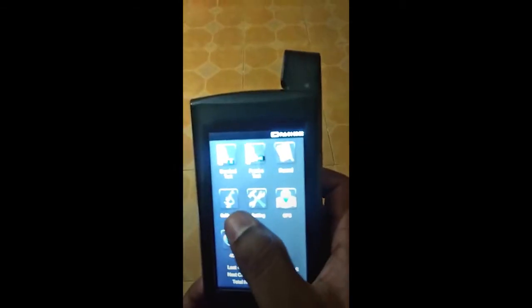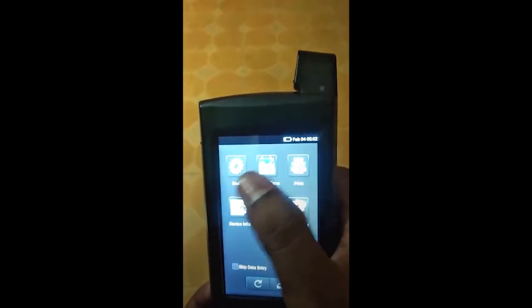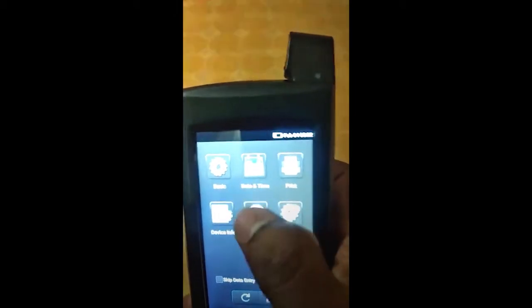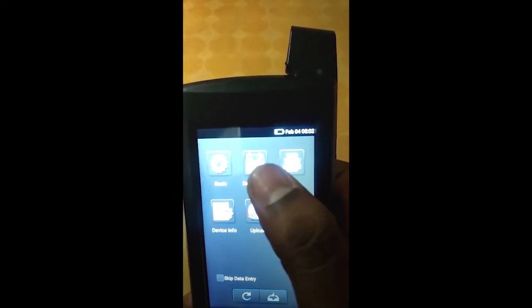We have a calibration window and we have settings here to set the basic things, like the date.